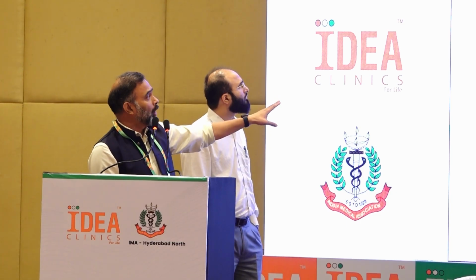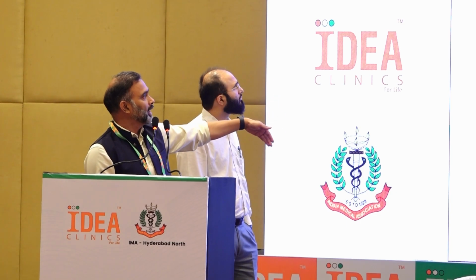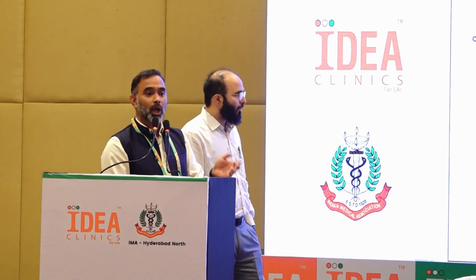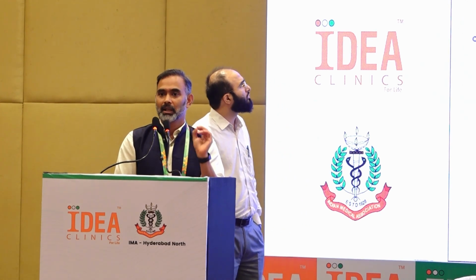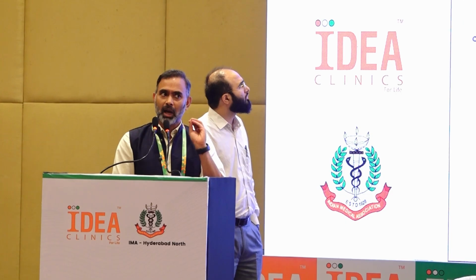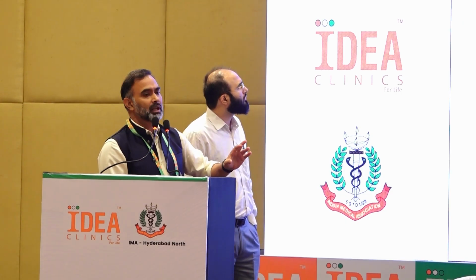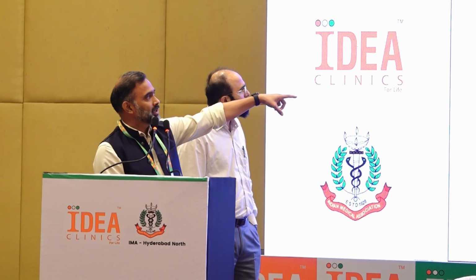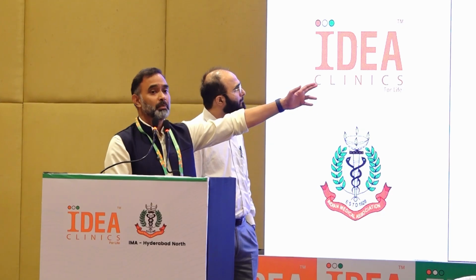So we see a lot of these graphs on the report. What is the total daily dose? How much auto correction is going? If there's a lot of auto correction, we increase the bolus. The only thing the patient has to do is enter the carbs he's taking in. Approximately, he doesn't have to carb count exactly, just the roughly amount of carbs. And then we can find out how much the bolus is, how much correction is going on, where the patient is spiking.